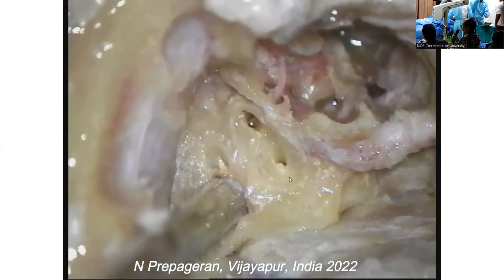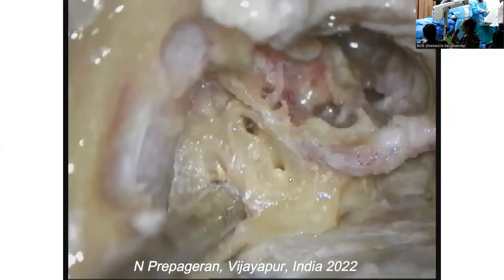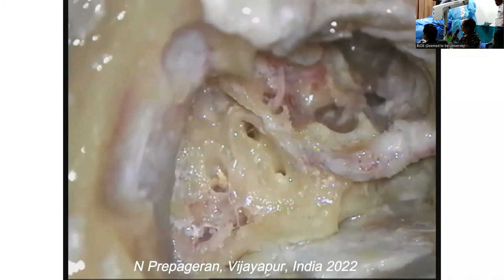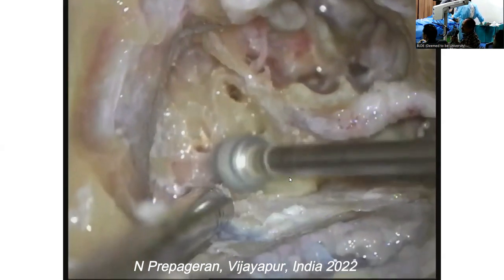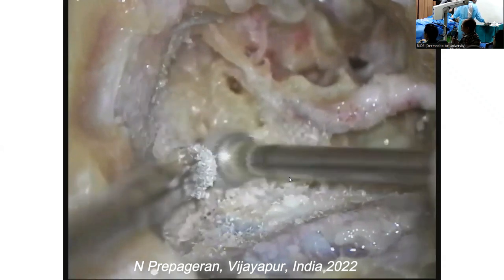So now, this is too small. It's okay. No problem, guys. There are three canals with two openings on either side, but overall there are only five openings. It's a bit big, because of the crus commune. So now, I'm going to open the posterior.